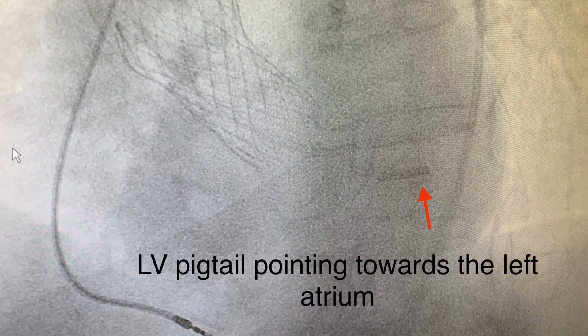But if we go back to the angiographic view, we notice that the LV pigtail is actually pointing towards the left atrium. So what happened is that the LV pigtail popped into the left atrium and the pressure that we were seeing is actually the left atrial pressure.